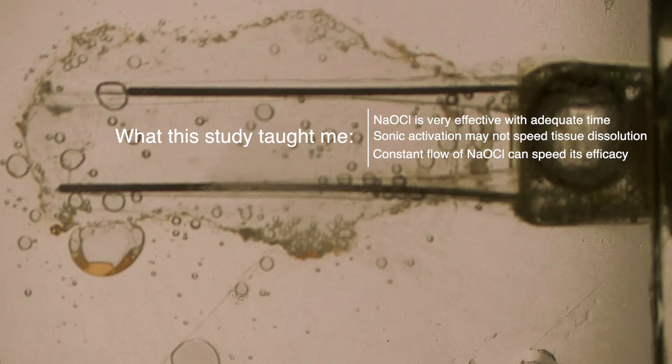The final thing that I found was that, and I've read this, but I never really understood it. I never twigged to it on a deep level, was that constant flow of sodium hypochlorite can speed its efficacy. And we saw that with the constant negative pressure irrigation, constantly delivering hypochlorite to the pulp chamber as the irrigation process goes on.